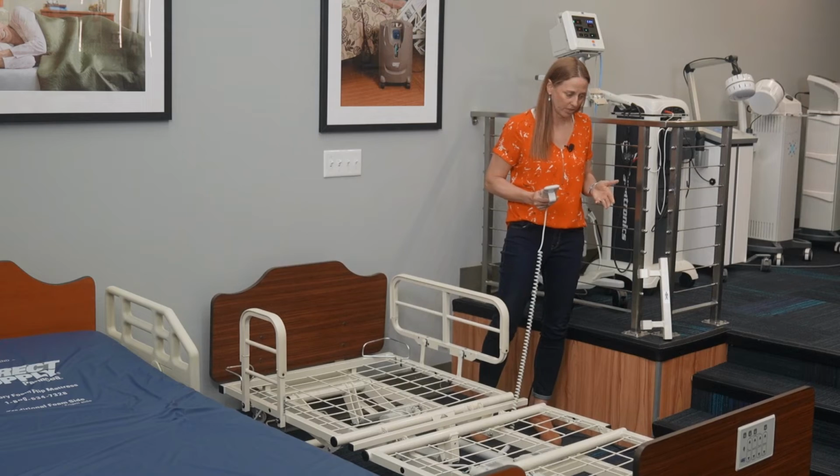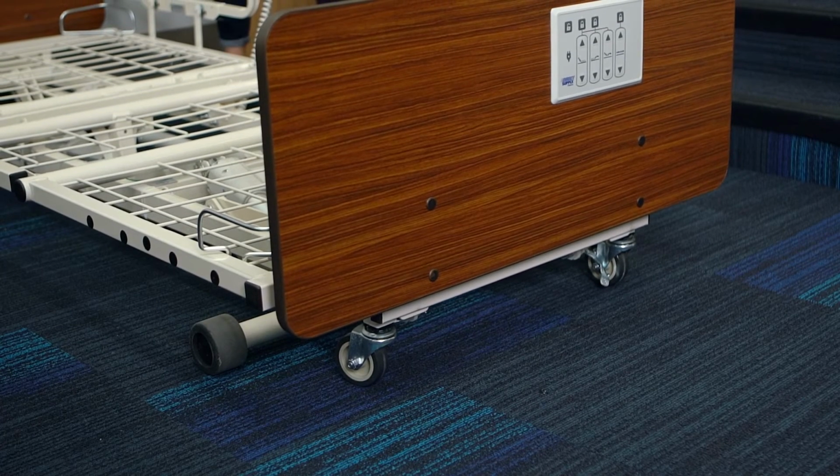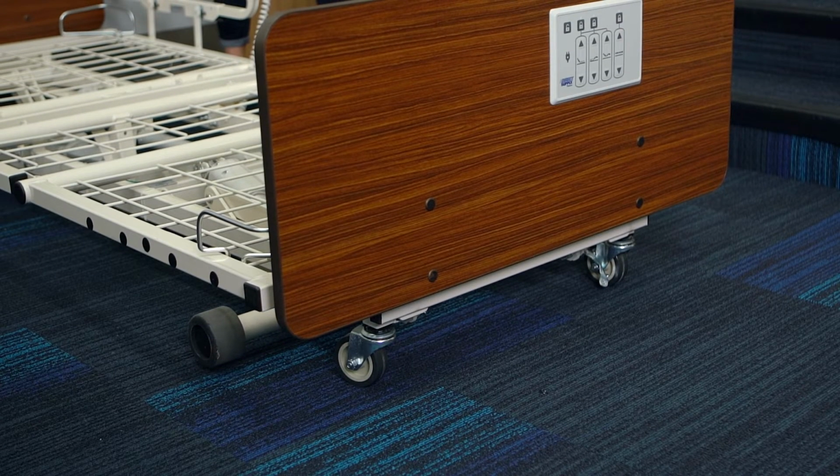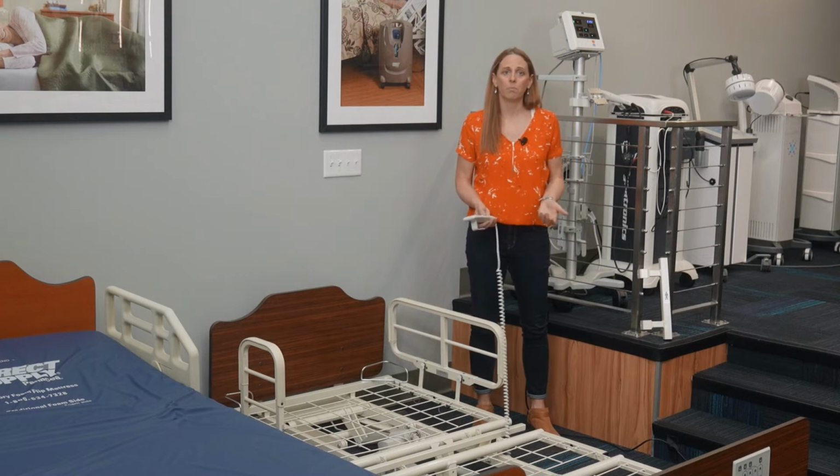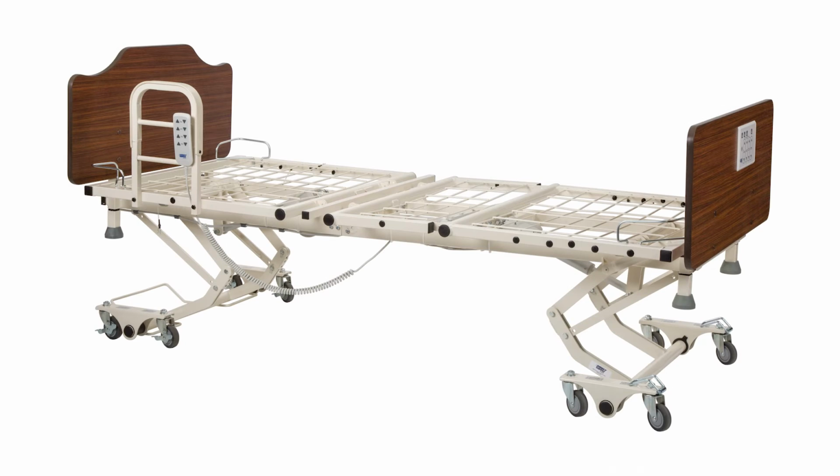The bed has two different mobility options. You could either have a bed that's roll-in low, which I'll show here. You can see as the bed lowers, the casters are going to touch the ground and the feet are going to pick up, and now the bed is mobile. Or you could do it mobile at any height, which you can see in the picture here, where all the casters are on the floor at any given time and would need to be locked to be secure.